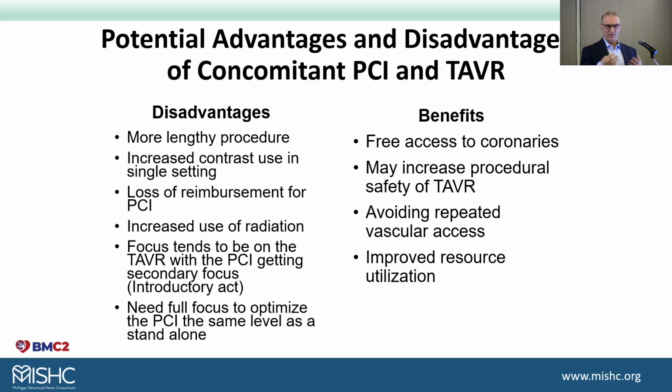There's a loss of reimbursement for PCI at the time of the TAVR. Increased use of radiation, or at least perceived increased use of radiation. Focus tends to be on getting the TAVR done, with the PCI getting secondary focus, whereas when I'm doing PCI, it's the most important thing at that time. The PCI is just an introduction to the TAVI, and you might not be doing the PCI with the same level of intensity you do when you're doing a dedicated PCI. You need to fully focus to optimize the PCI at the same level as standalone. The benefits: free access to coronaries because you do it before the TAVR is implanted, may increase procedural safety of the TAVR, avoid repeated vascular access, and improve resource utilization.